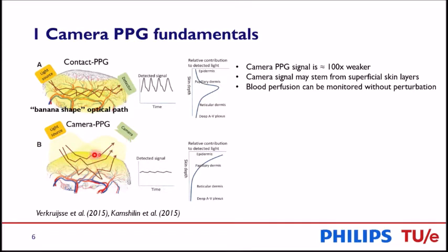And it may also sense the mirror-like specular reflections directly from the skin surface that have no pulsatile information.